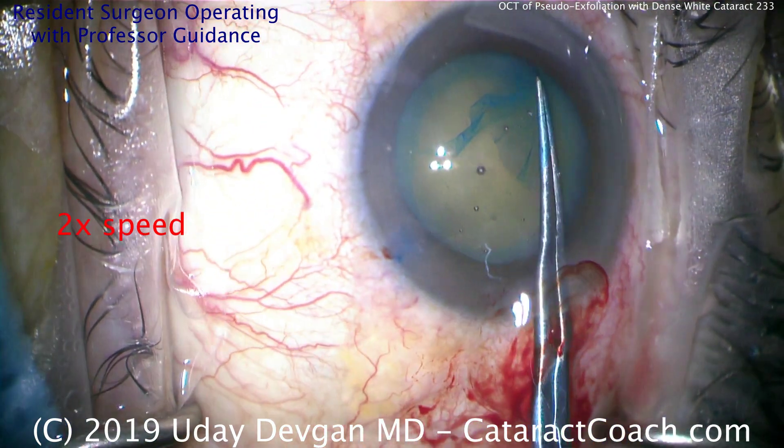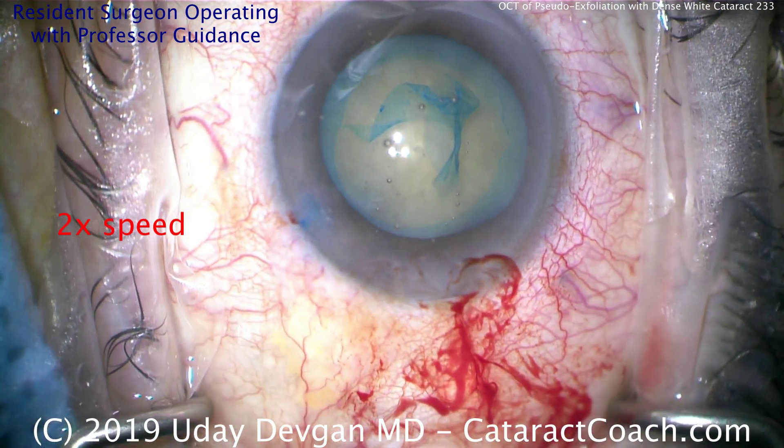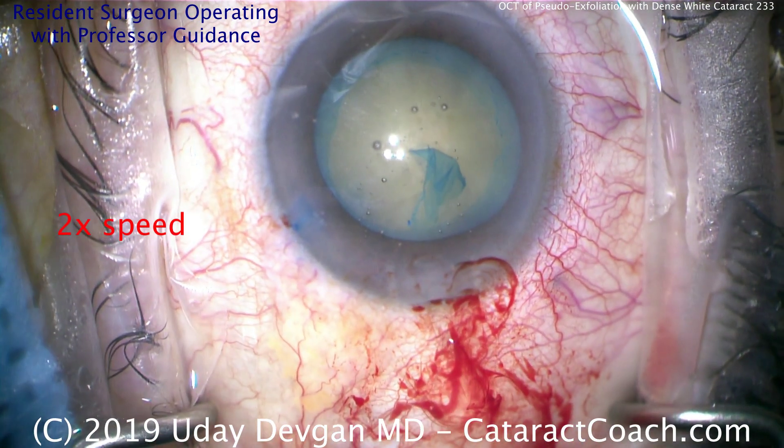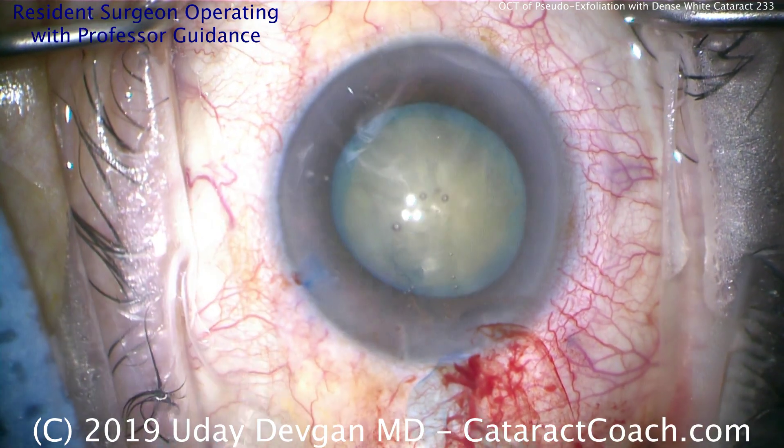Do not make a baby capsulorhexis. Also, this is a white cataract with a good amount of nuclear density, and you don't want to have to struggle to remove it through a very small capsulorhexis. So again, at least a five millimeter capsulorhexis — that's important.